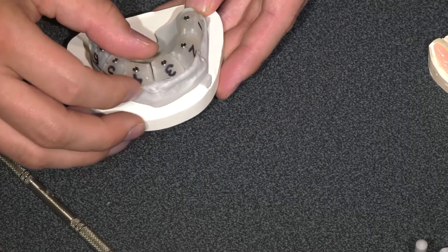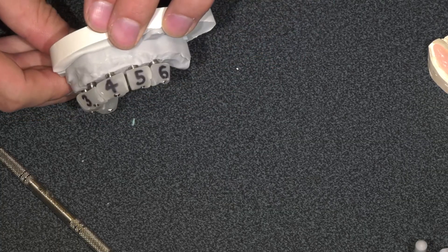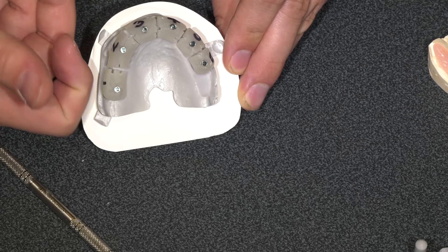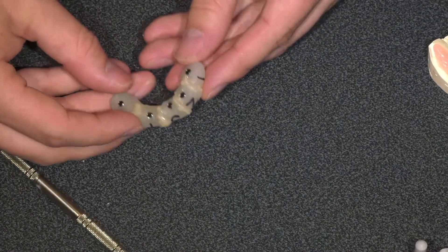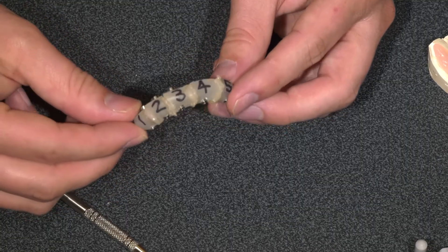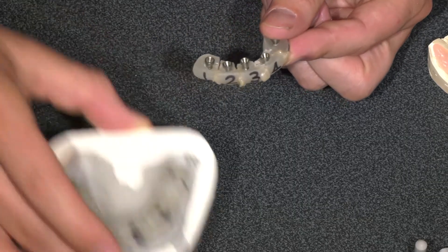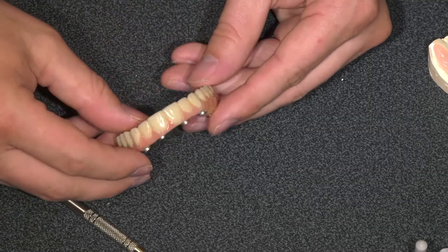At this phase of the V-jig appointment, we're going to unscrew this from the model — they've even nicely labeled everything, one through six, so you don't get confused. Put them in the mouth, just make sure they're not touching. What I'll typically do is apply some adhesive bond on the outside of the mouth and cure it, so that in the mouth when it's all luted, I'll use a bulk flowable and quickly lute all six or however many pieces there are. Once that's been luted, do not attempt to put it back on the model — if there are any passivity issues, which there typically are, it will crack. Send this back just wrapped up lightly in bubble wrap, along with your wax bite, and what you'll get back is a provisional PMMA.